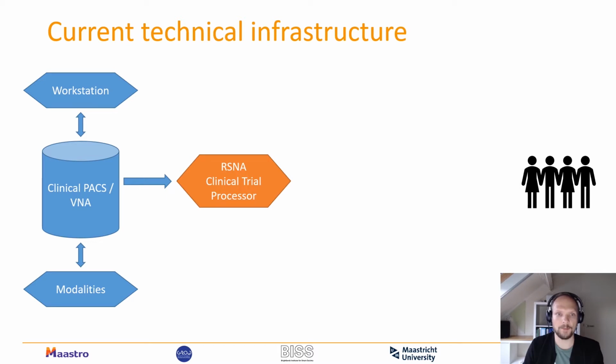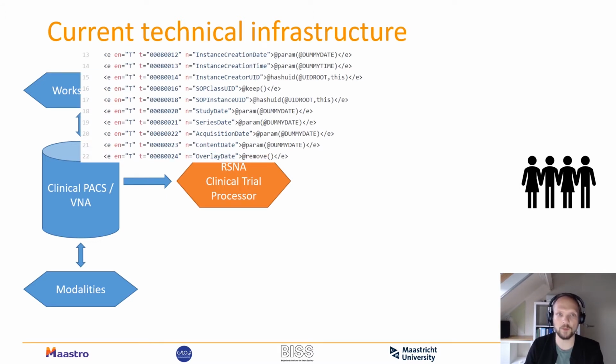All that information can be de-identified using a rule-based system in an XML standard, where for every metadata element you can decide what you want to do with it.